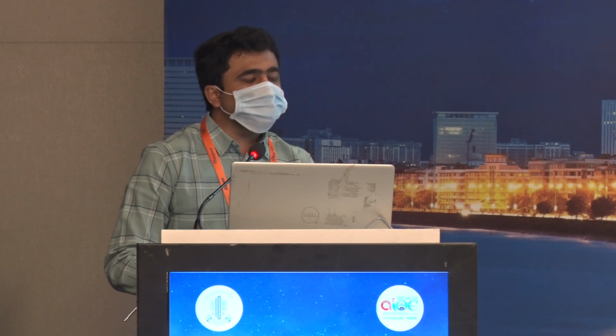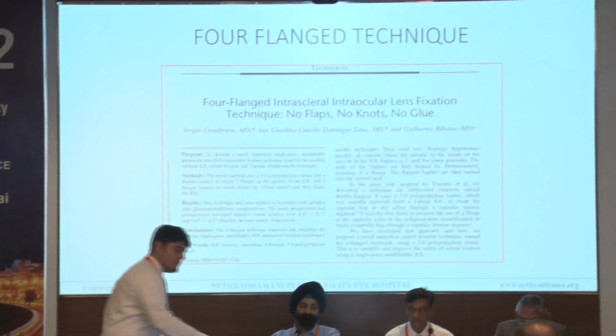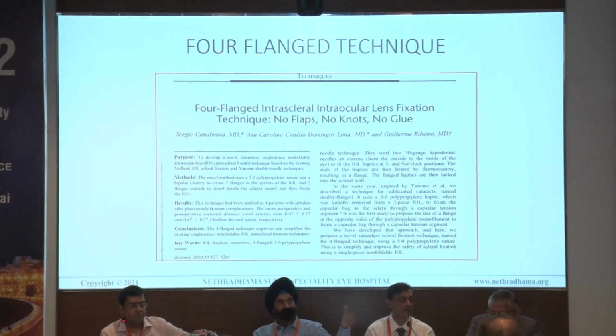And the recently developed Yamane technique is generally technically challenging, and IOL decentration and tilt are also more with this technique. Dr. Sergio Canabrava described the four flanged technique, which is the intrascleral intraocular lens fixation technique with no flaps, no knots, and no glue.